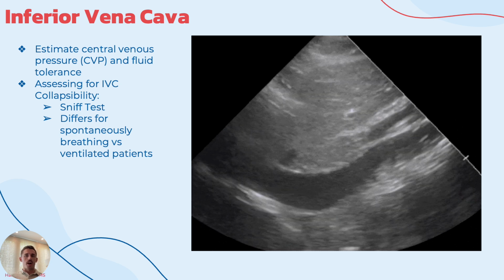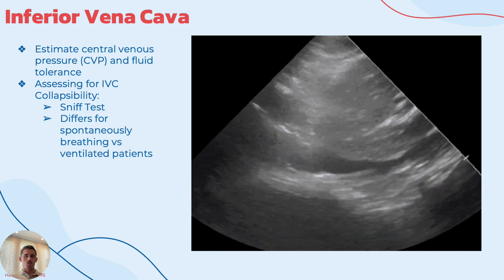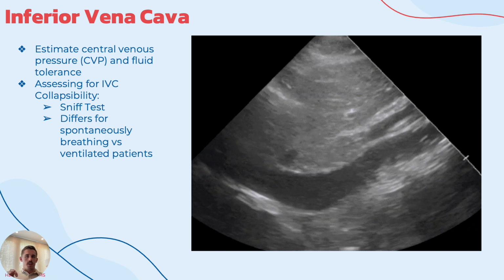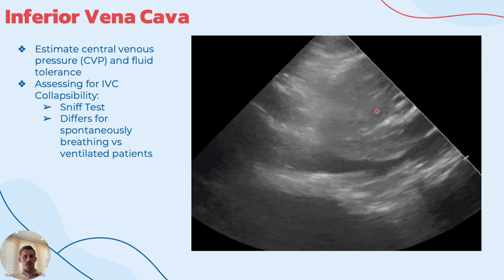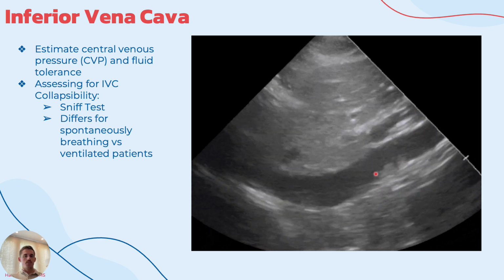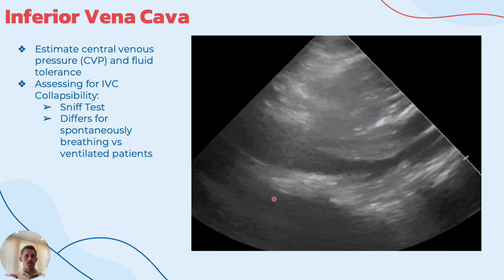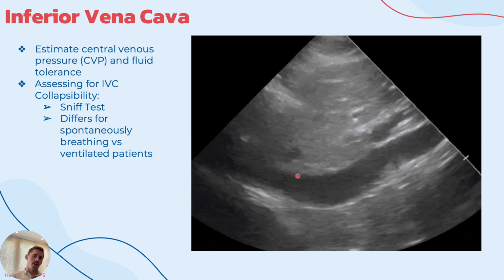So from the subxiphoid view, with a patient still in the supine position, you can bend their knees if you want to bring fluid back into the thoracic cavity. You want to keep the right atrium in view. So you locate the inferior vena cava with the liver on the center of the screen. So here's liver. And then you need to know that it's your IVC because you see it dumping into your right atrium here. So once the IVC is centered, you can rotate your transducer to bring your indicator toward the feet. And then you get a longitudinal view of the IVC entering into that right atrium.